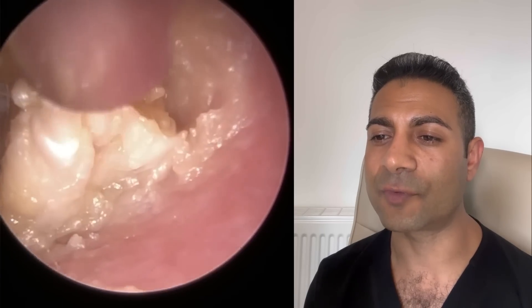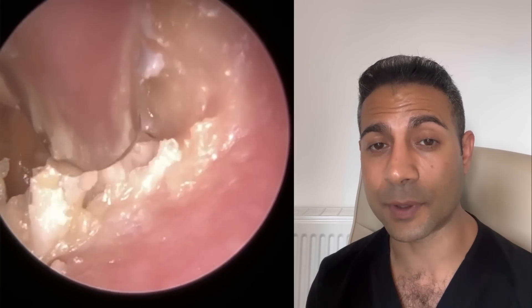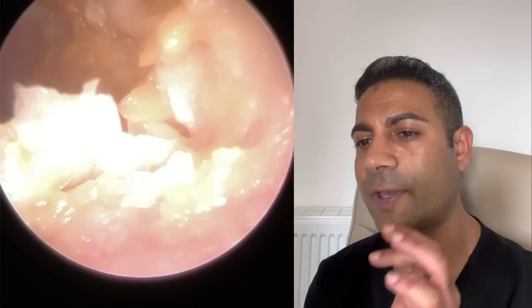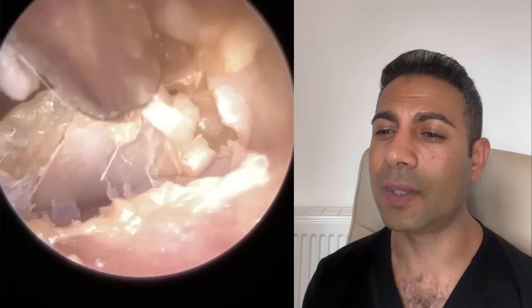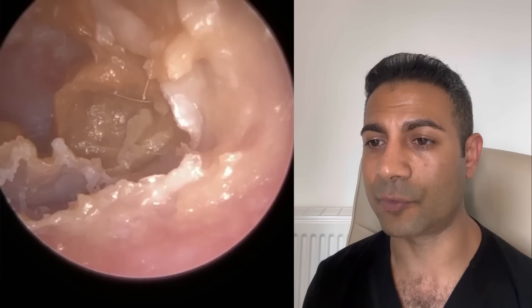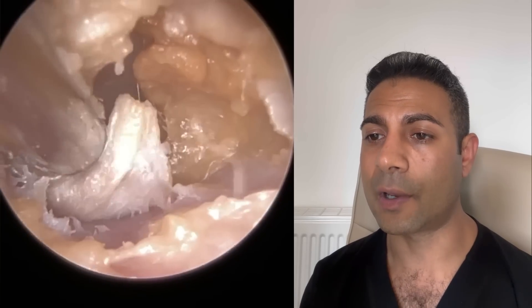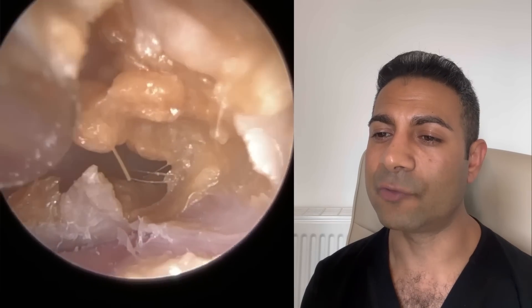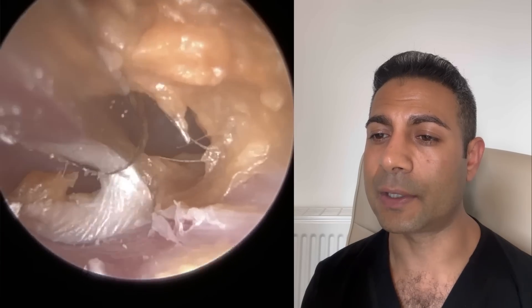It's not as infected or severely infected as their right ear, but they have got this accumulation of dead skin and debris very deep in the ear canal, which wasn't really causing much of a hearing loss. You can see there is a bit of an opening there for sound waves to travel through and vibrate against the eardrum. But their main complaint was itchiness and irritation.